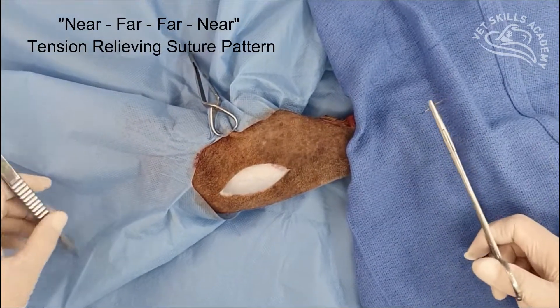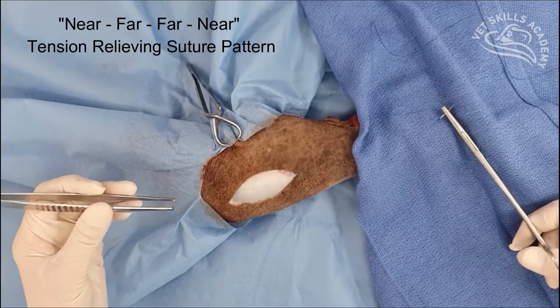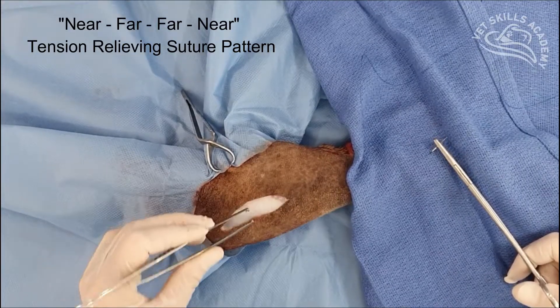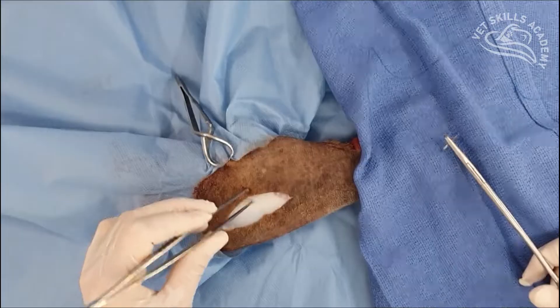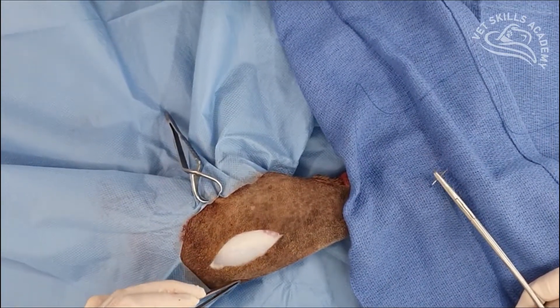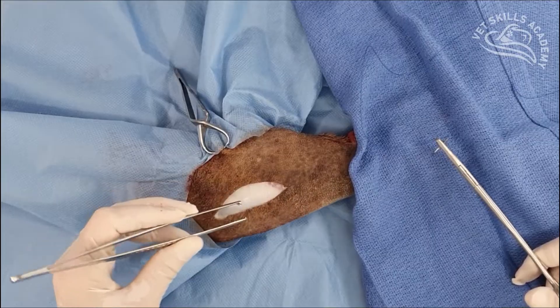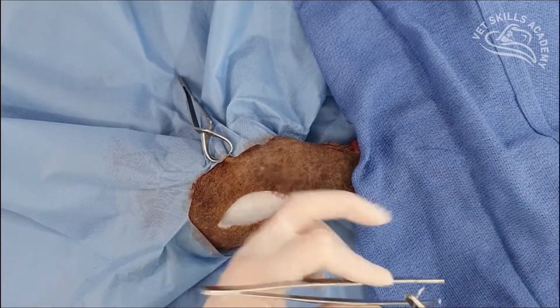Alright, here we're going to be doing a demonstration of a tension-relieving suture called a near-far, far-near. Every now and then you may find yourself in a situation where the skin closure will result in a little bit of tension, but it will close. You can do tension-relieving incisions, but in this case we've decided we can close this with just using a tension-relieving suture pattern. This is a cadaveric specimen that we're using here.